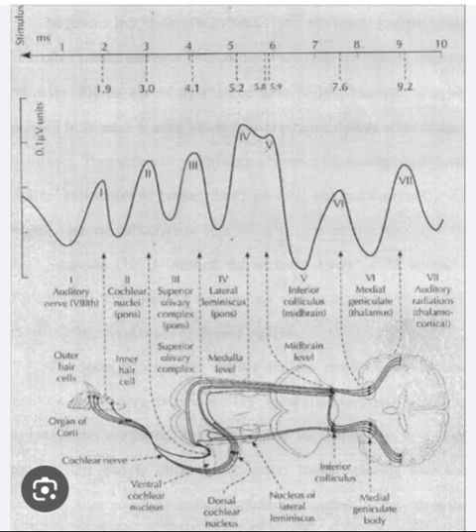Electrode placement. Electrodes are placed on the scalp to record the electrical responses generated by the auditory pathway. The placement of electrodes follows the International 10-20 system, which ensures consistency across different recordings. The specific electrode configuration used for BERAs typically includes an active electrode over the vertex, Cz, and reference and ground electrodes at specific positions. Proper electrode placement is vital for obtaining accurate and reliable results.